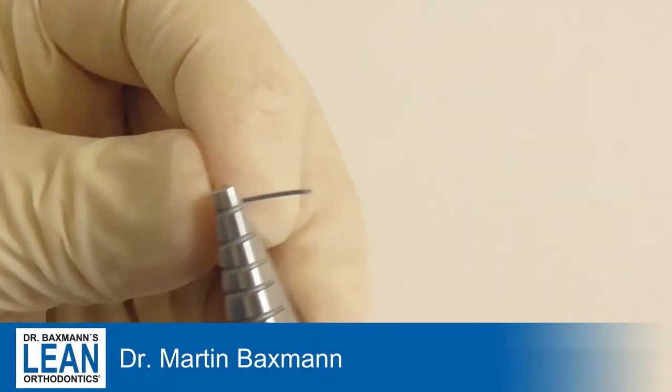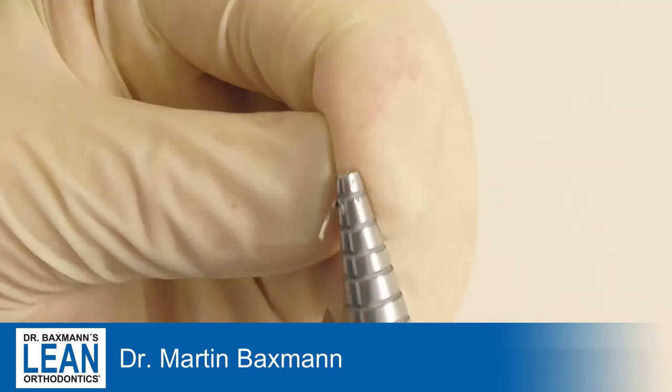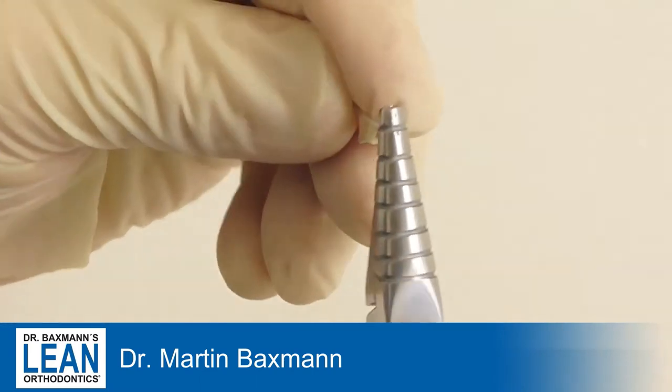The cantilever wire is such an important tool for you to know how to bend, because you use it for every canine and even for impacted fives, and sometimes you can even use it for intrusion or extrusion arches.